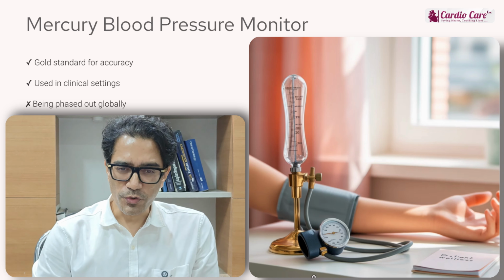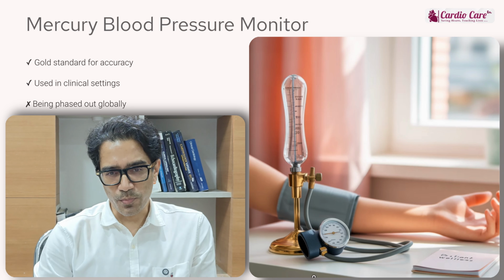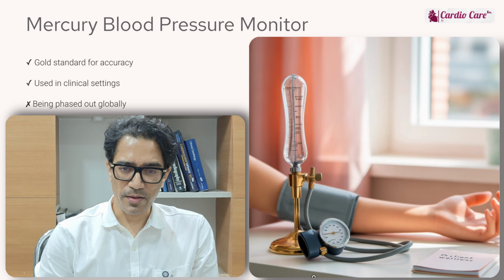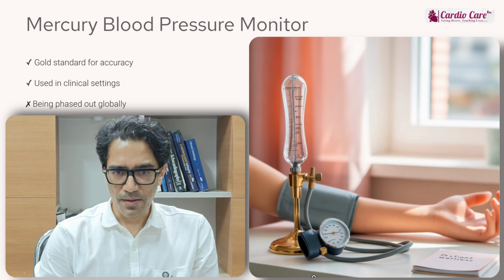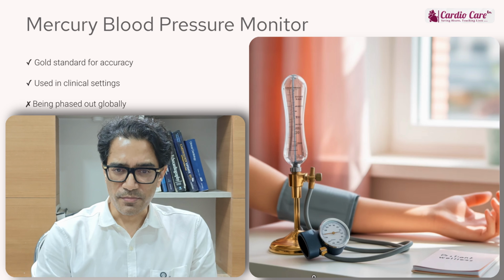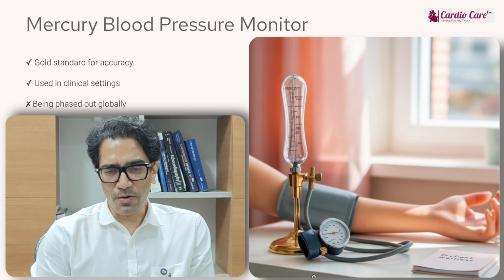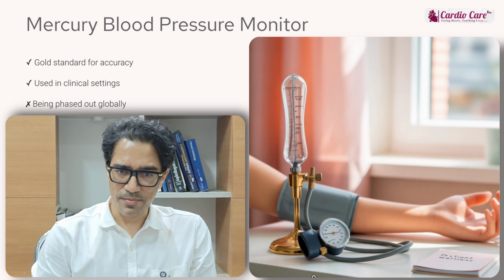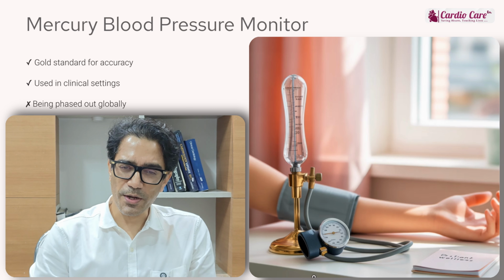So which blood pressure monitor should you choose for home blood pressure monitoring? There are various blood pressure monitors available, but the most common, which has been used for a long time, is the mercury sphygmomanometer, and this is the gold standard, considered one of the most accurate blood pressure monitors. But it is nowadays being phased out in various countries because it has its own drawbacks. The most common drawback is that it uses mercury, which could be toxic, especially if there are mercury spills, which can be toxic for health.